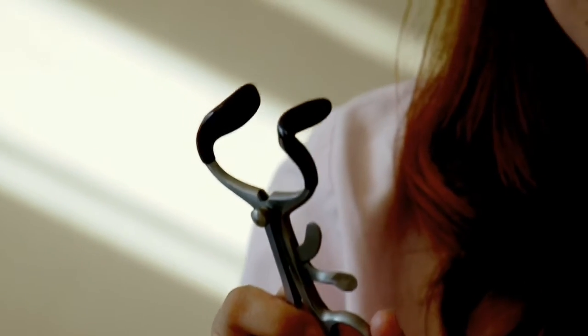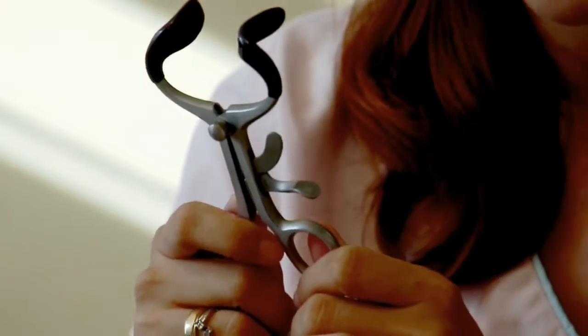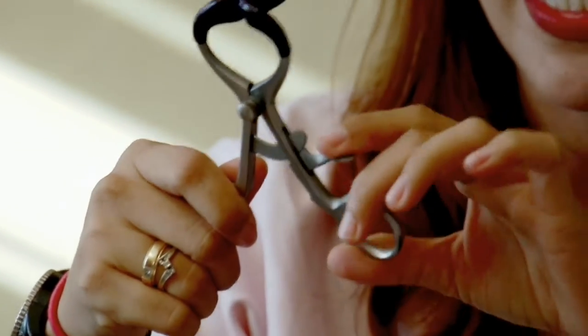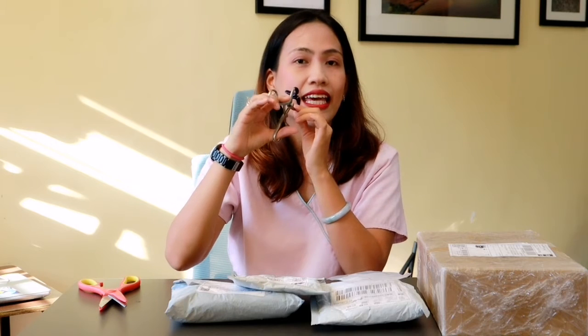For anyone who has not seen this type of retractor, I will show you how to open it. It's very easy — all you have to do is pull this down and you can now open it. To demonstrate, it's like putting it inside my mouth. That's why you have the rubber part, so it will not be too cold or painful for the patient. Then you use the retractor here to open the mouth of the patient. I'm very happy with this one — five stars to this product.